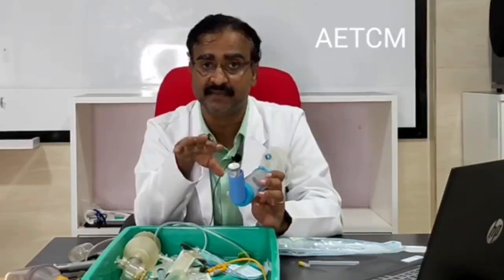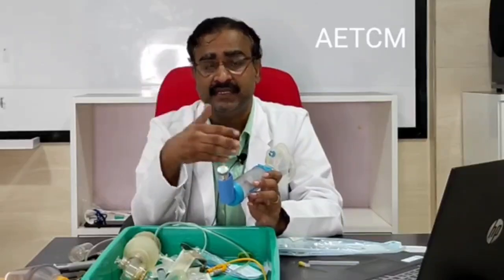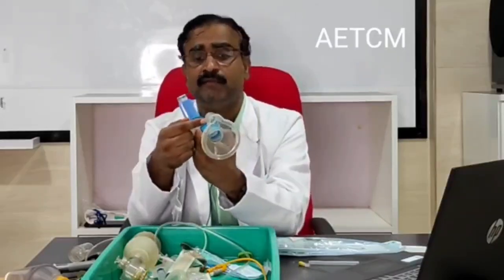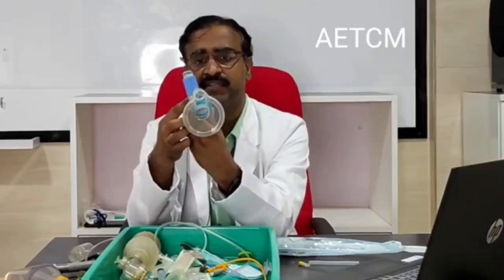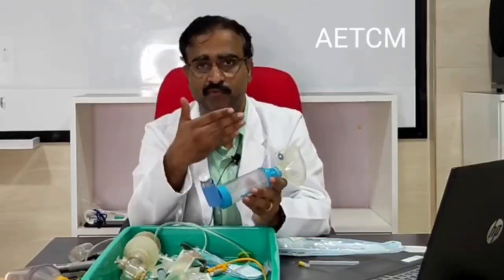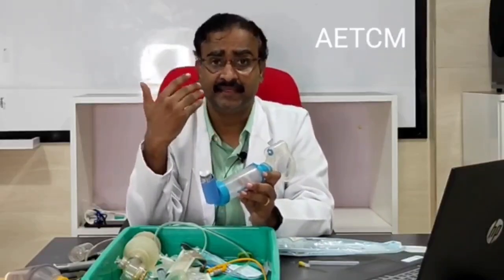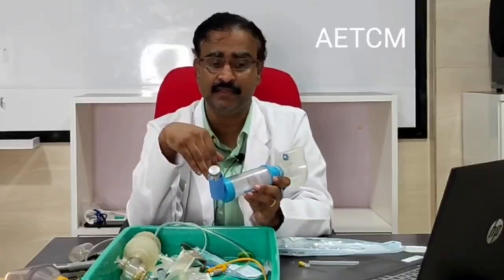Now how do you know whether the child is able to get the drug, and how would the parent know whether the child is getting the drug? Well, there is a valve here, if you can see, a blue color structure which is a valve. That would begin to move with each inspiration or expiration that the baby or the child takes. That means that the drug is getting delivered into the child. So that is the way you use it.